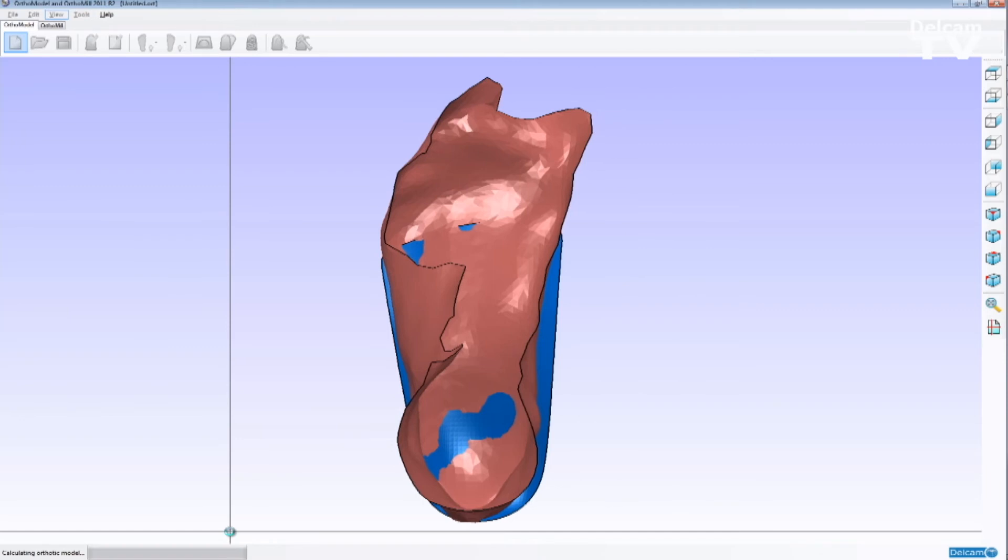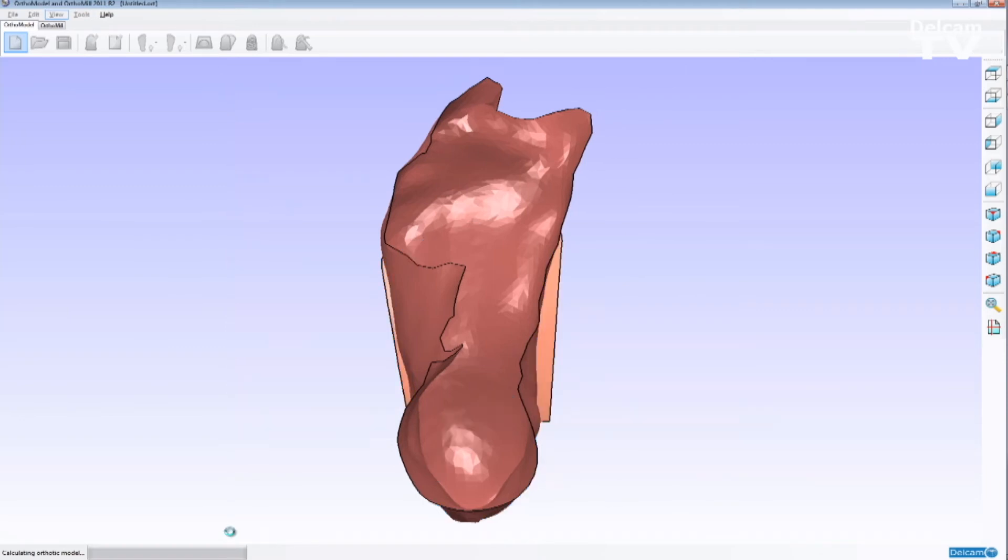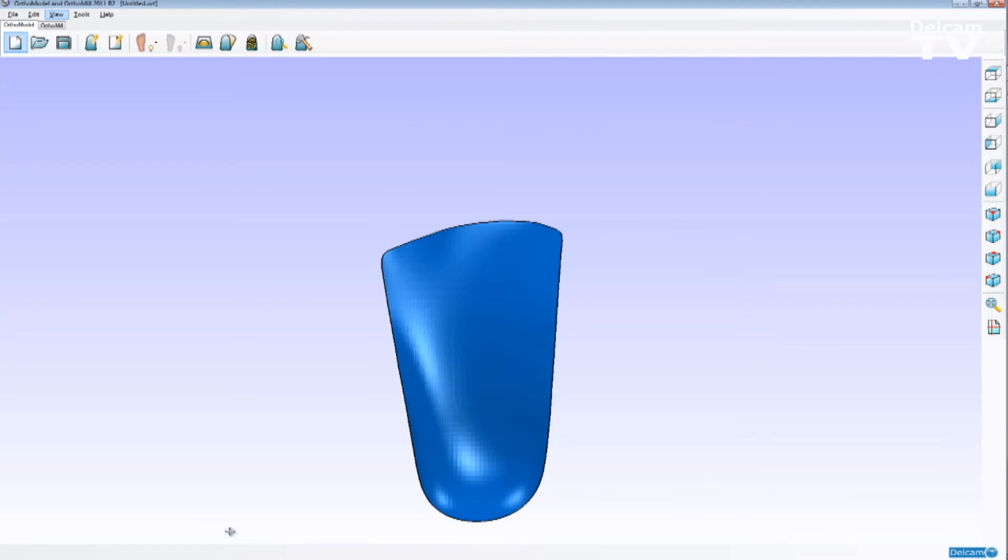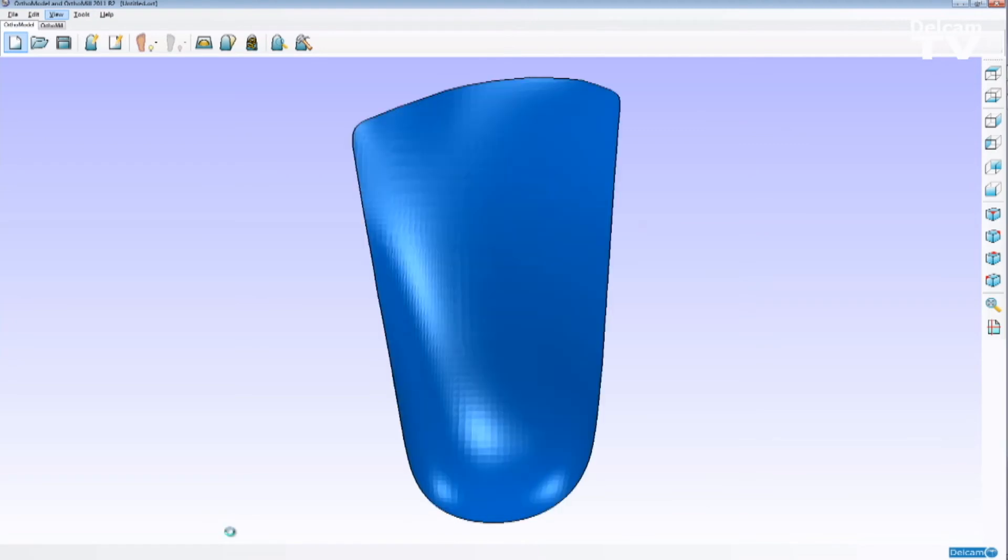After we design the orthotic, we can do cutouts, do a first met cutout or a heel spur cutout. We can add metatarsal domes or plantar fascial grooves and etc.